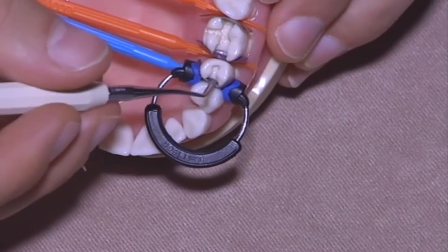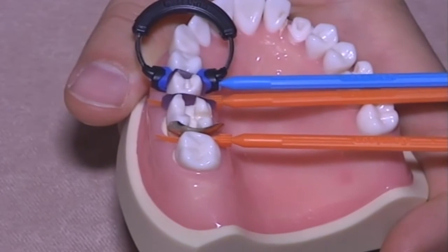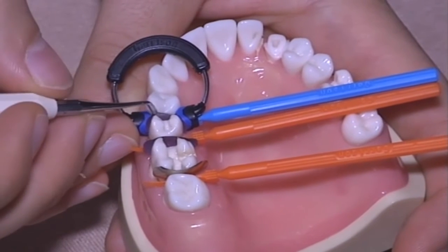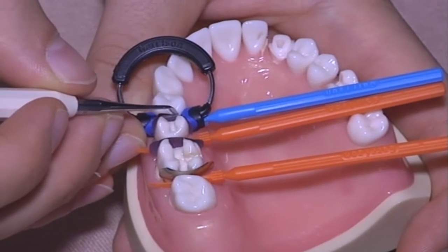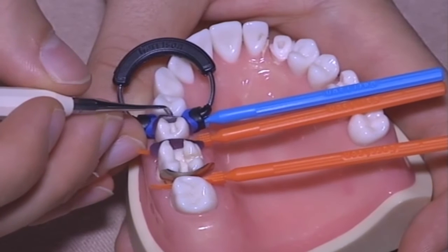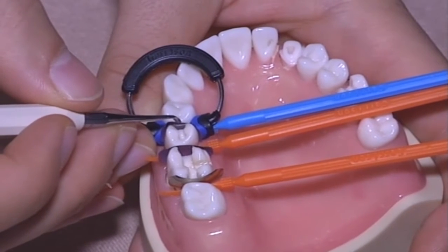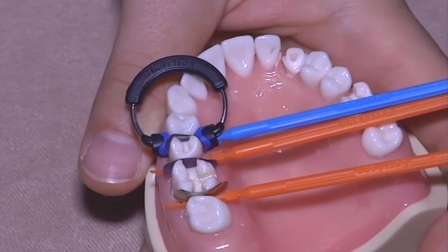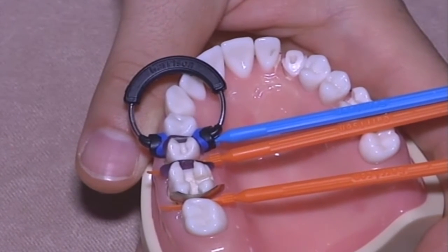Okay, once you create the wall, you see that here you have composite which goes a little bit higher, and it is correct because before curing it you have to do these movements in order to create the part of the tooth, the marginal crest, that begins to turn towards the occlusal surface.